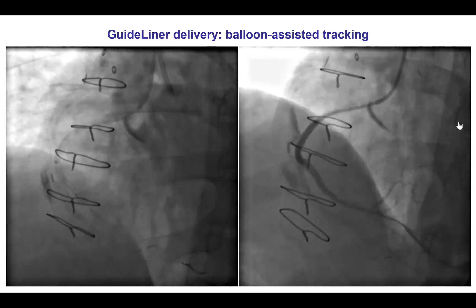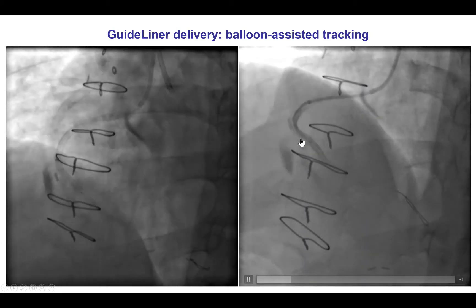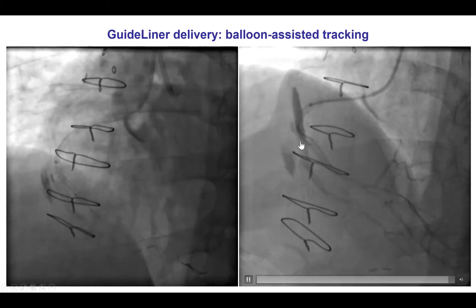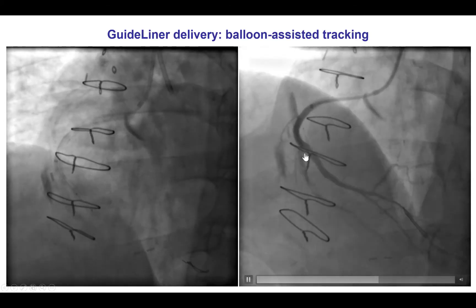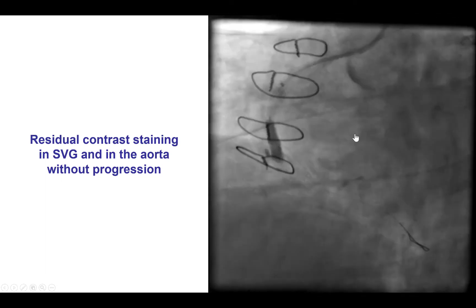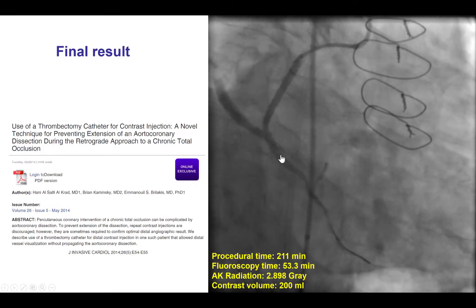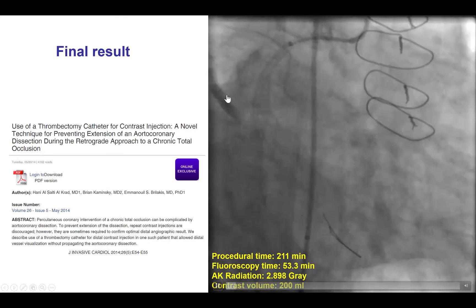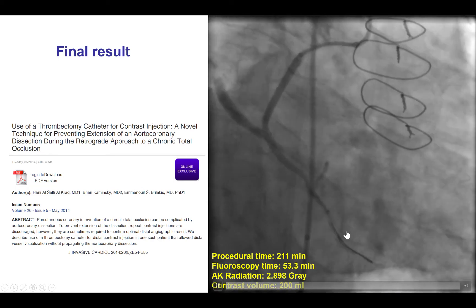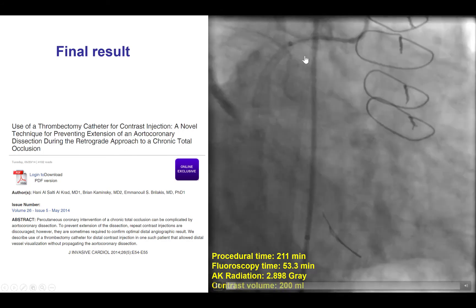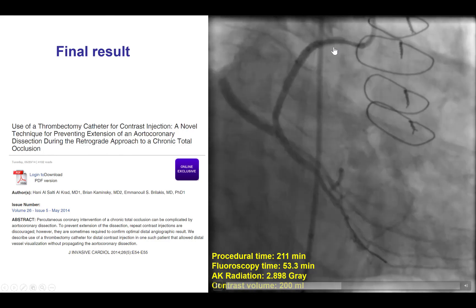We were able to deliver a guide liner so that we didn't inject contrast and propagate the aortocoronary dissection. We definitely wanted to take a better look at the area of perforation that appeared to have sealed, but we wanted to be 100% sure — especially given that this is a previous coronary bypass graft patient. In those patients, it is known that perforations could be very risky and cause localized tamponade. However, that area of perforation appeared stable and was not changing. Therefore we stopped the procedure. The graft was already essentially closed, so we didn't have to do any coiling, and we did confirm nice TIMI flow into the distal vessel. This is an example of using a guide catheter extension to prevent contrast injection in cases of aortocoronary dissection that can propagate the ostial dissection.